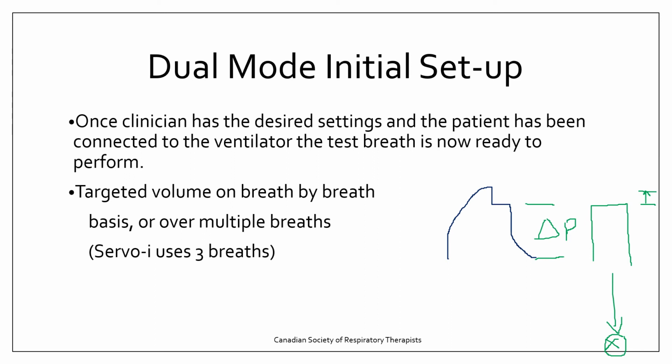And then again, it goes back to the ventilator, and the ventilator will assess that tidal volume that returns back to the ventilator, and it will say, hey, do I need to increase my pressure, or can I stay the same, or do I have to decrease my pressure?